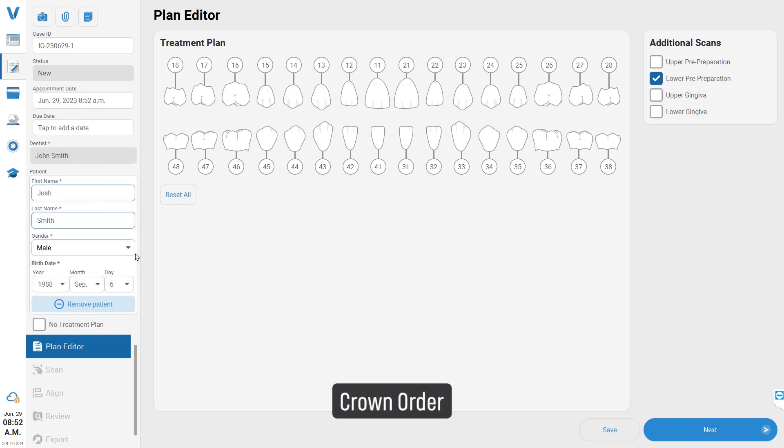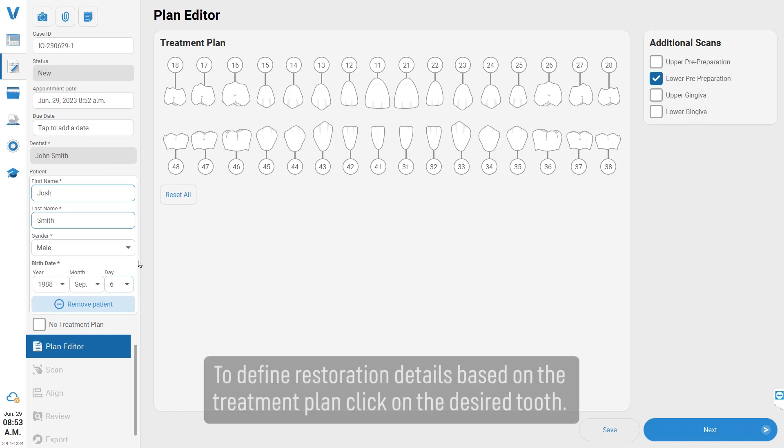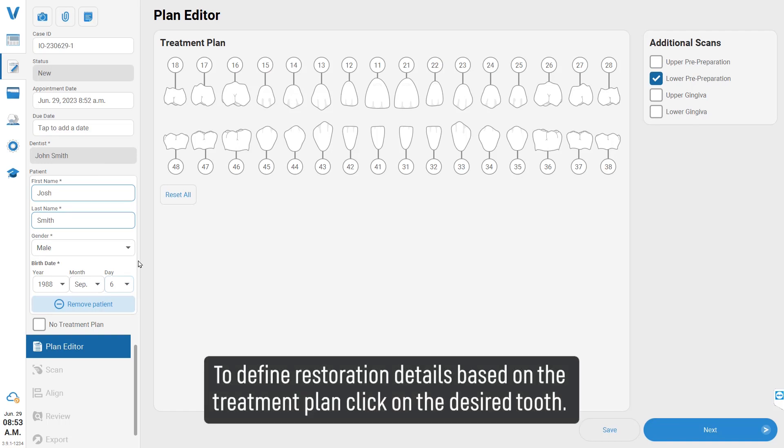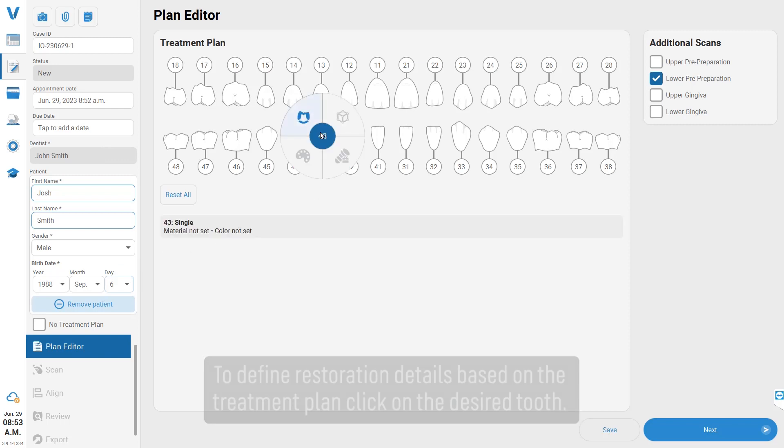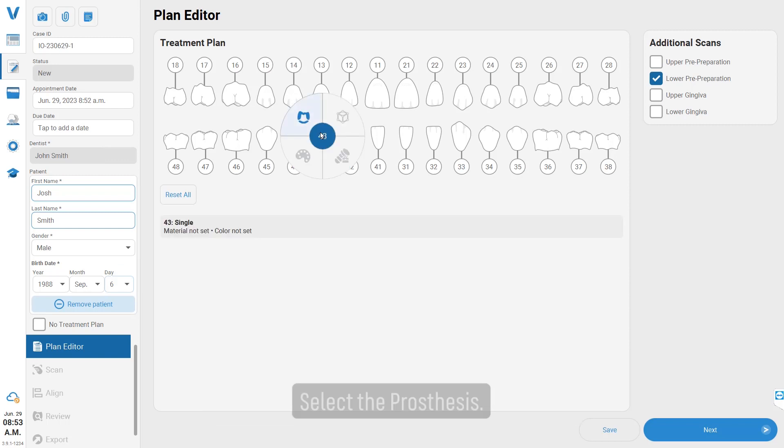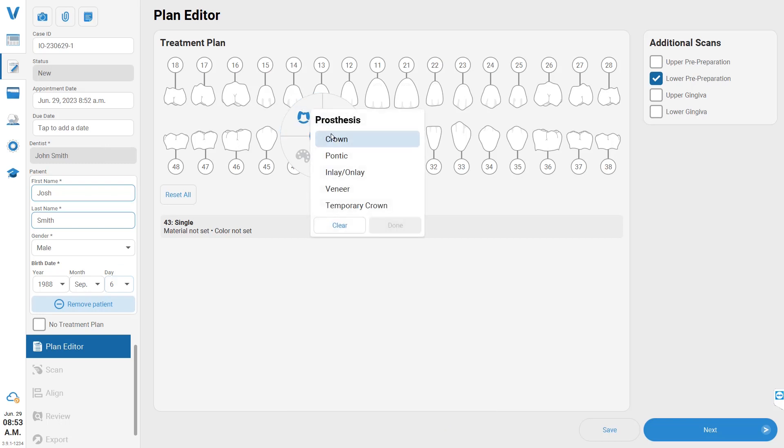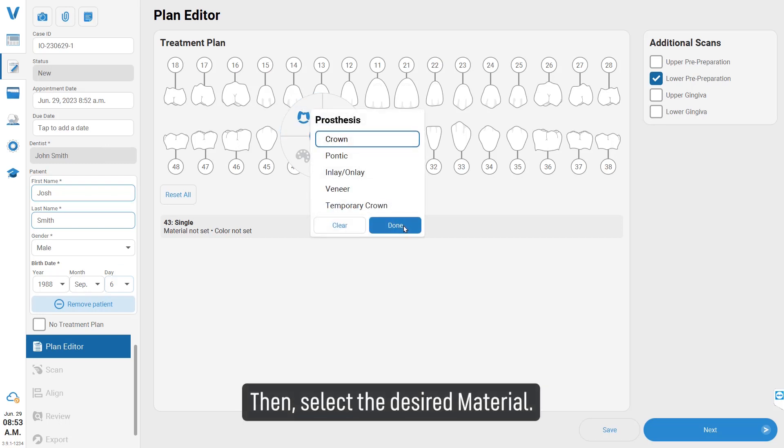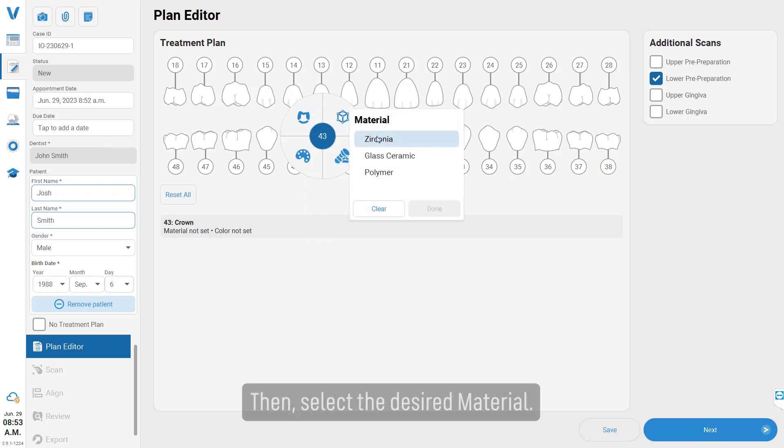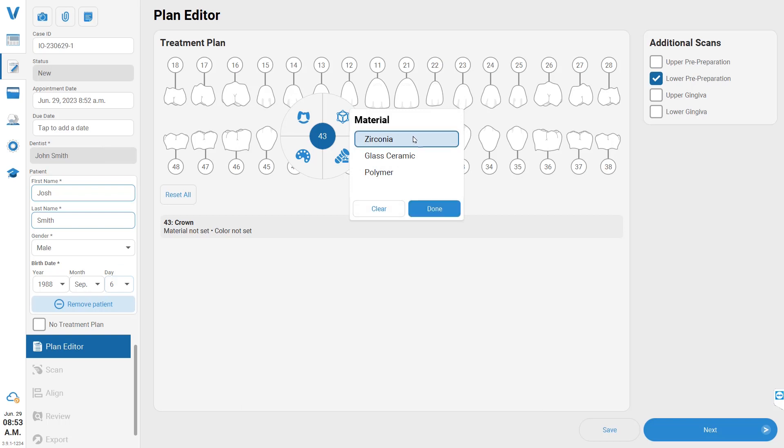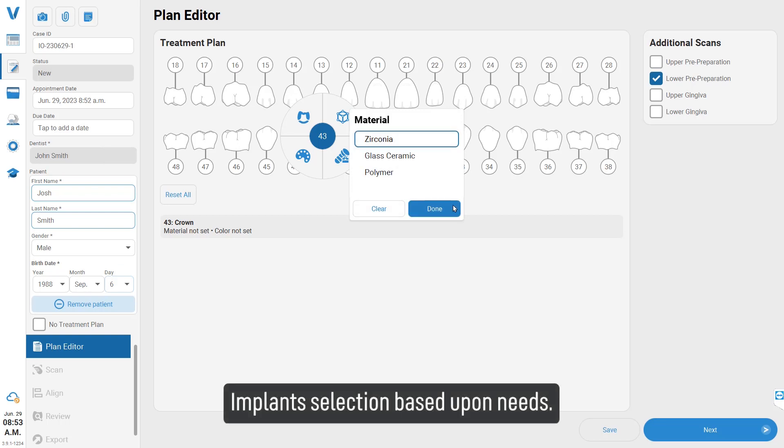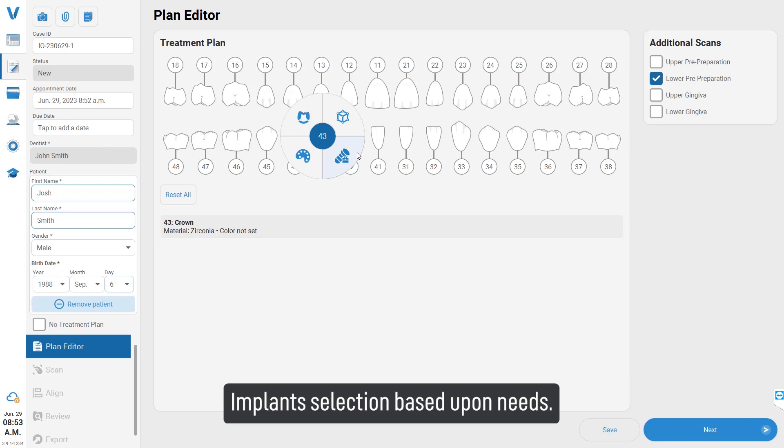Crown Order: To define restoration details based on the treatment plan, click on the desired tooth. Select the prosthesis, then select the desired material and implant selection based upon needs.